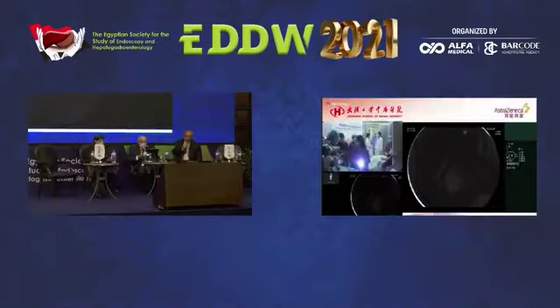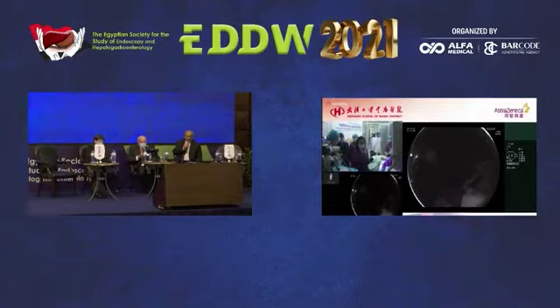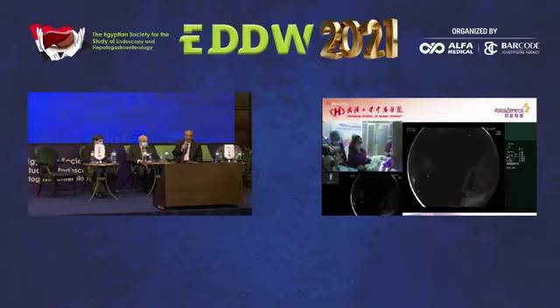Hello? Hello? Yes? We are ready in Cairo here for the first transmission. Dr. Jia will start. Please explain to us what you will do. Okay. Thank you. I'm ready to start. Good afternoon, everyone.